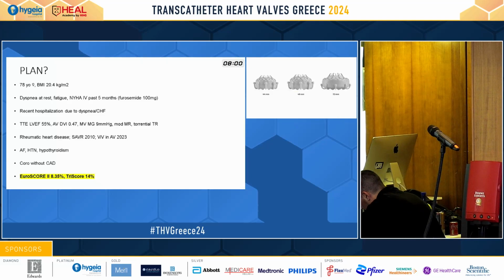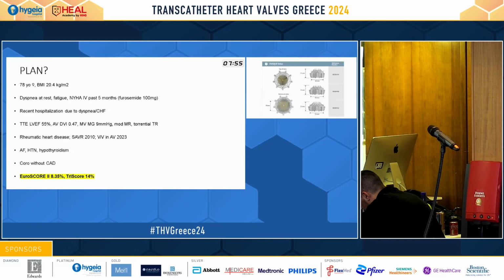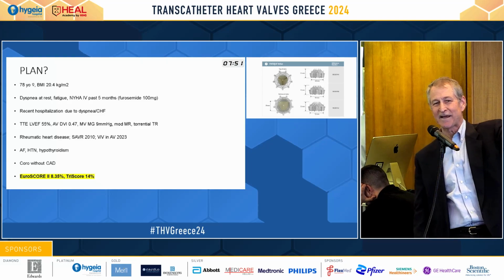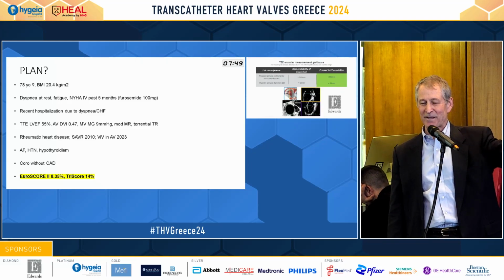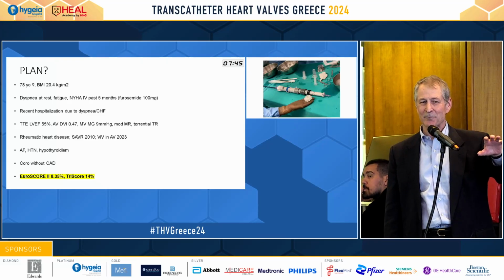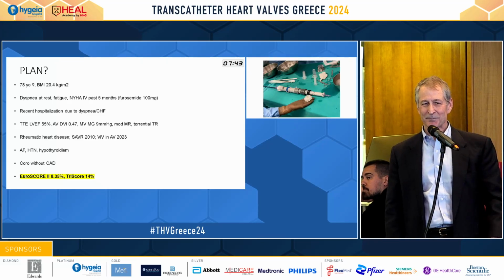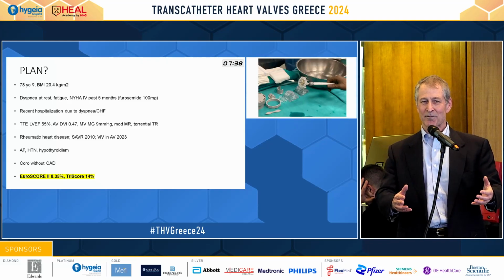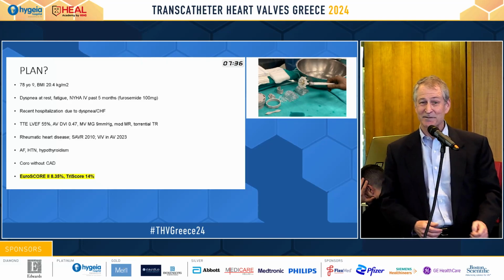So you think, if I understand it, we should start, as we always do, from the left valve, right? Well, there's a lot of reasons, but if you just look at that, that's a right heart that's failing on the basis of left heart disease. You fix the aortic valve, that mitral valve is causing more trouble than you think. But so if it was low risk, you wouldn't be doing an Evoque. You'd fix both valves if you really want to fix the patient, but it's clearly not a low risk patient.